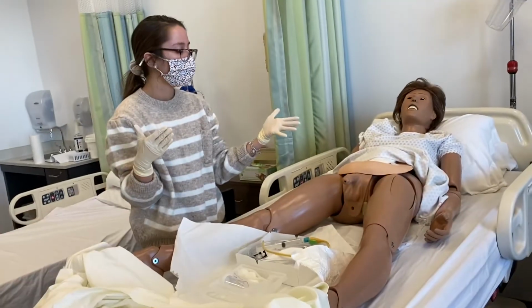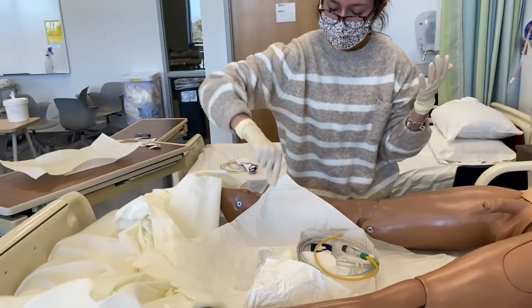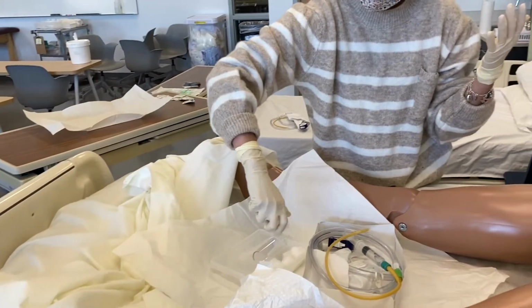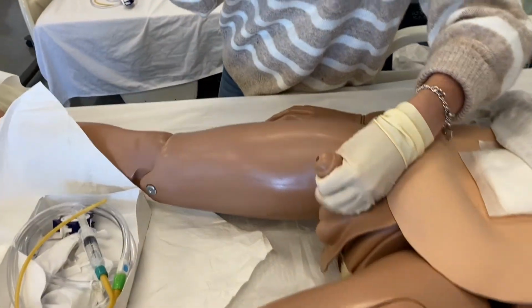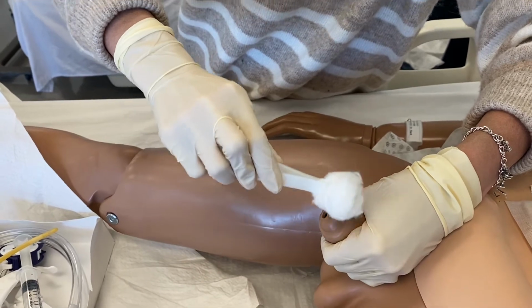Prior to beginning the procedure, we would want to perform any routine peri-care on Carl before we do the catheter. Then we are going to clean his penis with our cotton balls. I'm going to firmly grip him and clean in one circle.